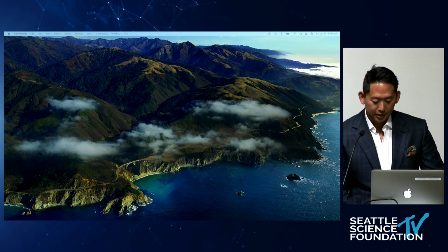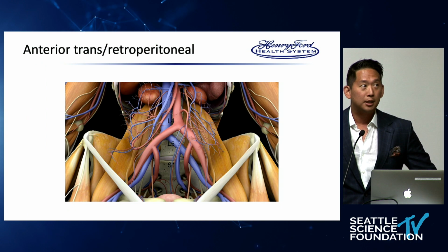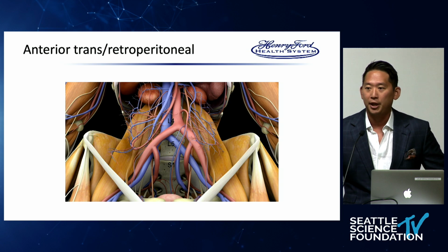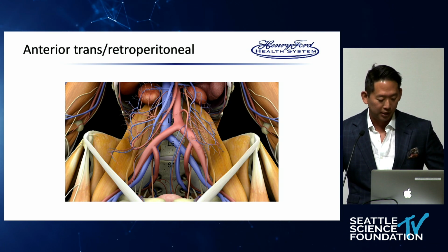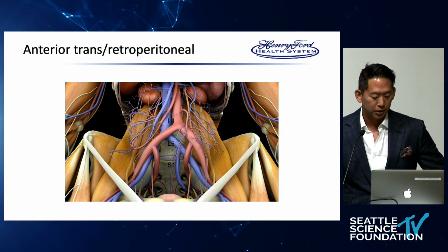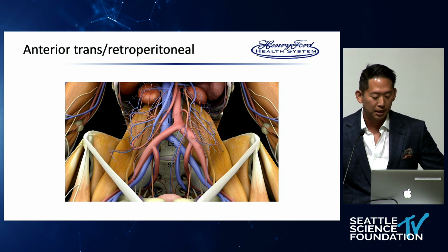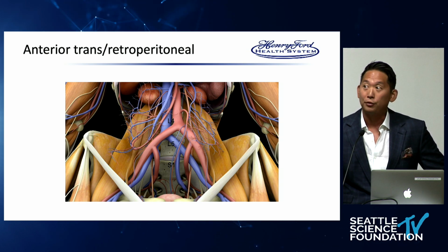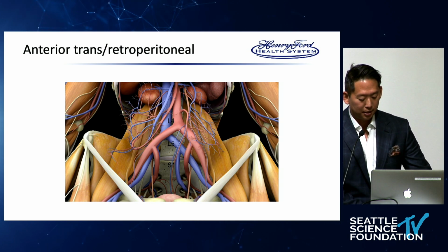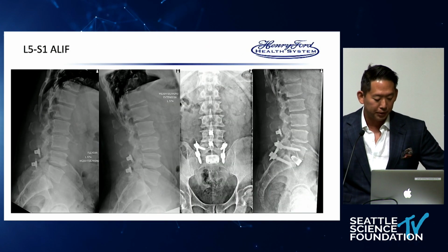Okay, so here's a diagram just showing the anatomy from the anterior approach. So again, we've got the vertebral bodies labeled. You can see naturally you're taking advantage of the bifurcation of the iliacs above the L5-S1 disc space, so you have a nice corridor to access this. There's a lot of different variations of where the vessels will sit more proximally, but you can see for things like L4-5, 3-4, and 2-3 are possible. It just depends on the anatomy and your approach surgeon.